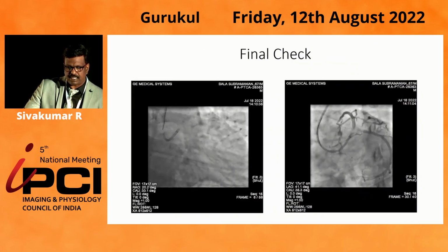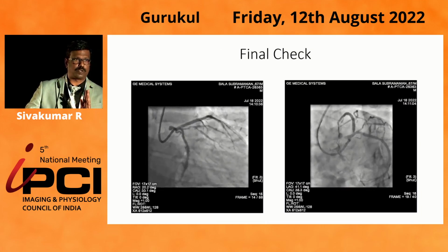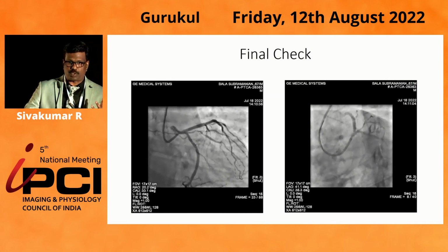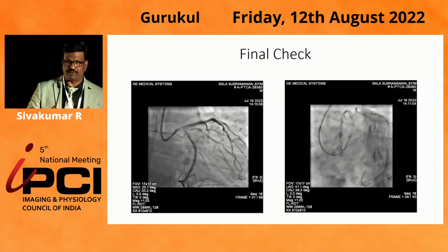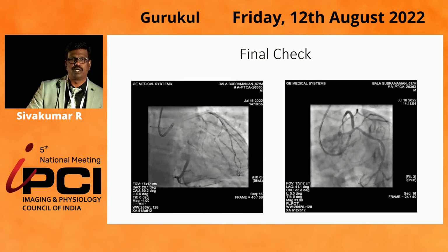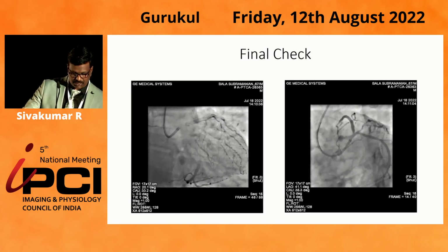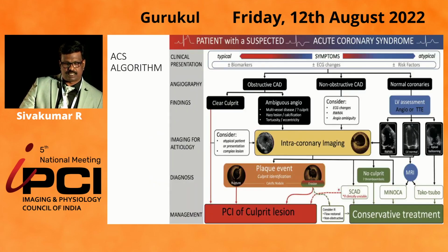In a diffusely diseased vessel, landing, sparing the ostium, proximal angiographically, is done without knowing what happened to the proximal edge. Now, OCT guided, proximally, I am very clear that I have landed in an area where there is no lipidic plaque, no eccentric plaque, burden was less, no edge dissection. I am confident. I think this was talked about, Harish.